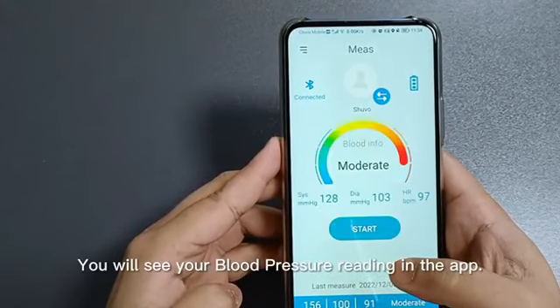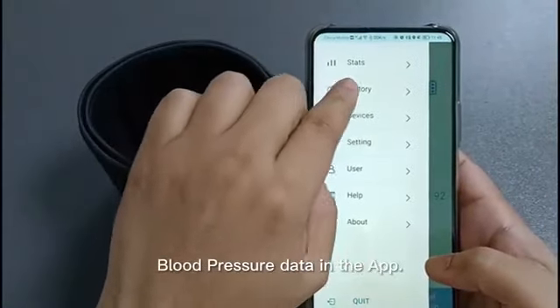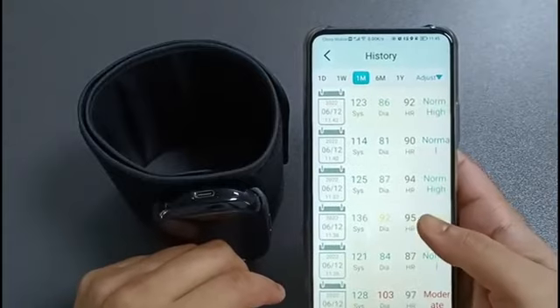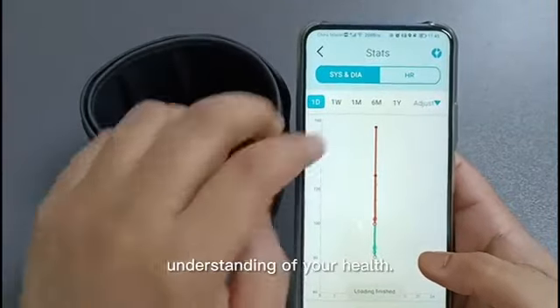You will see your blood pressure reading in the app. You can also see your previous blood pressure data in the app. The app will help you to analyze your blood pressure data for a better understanding of your health.